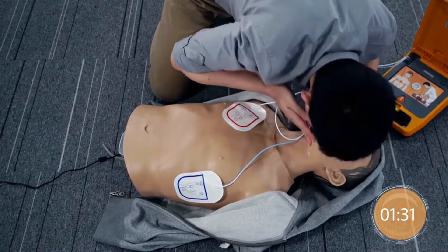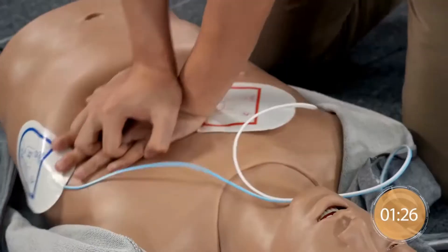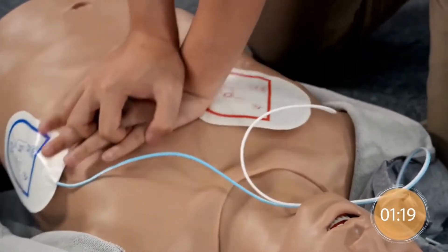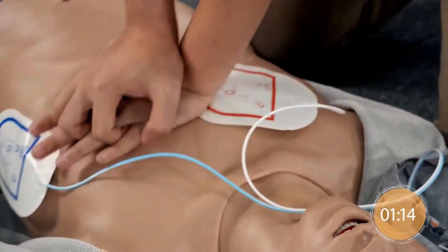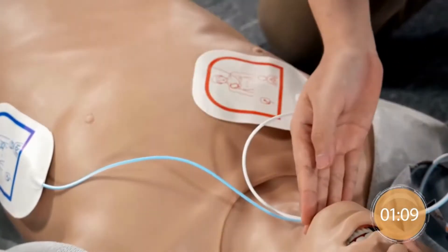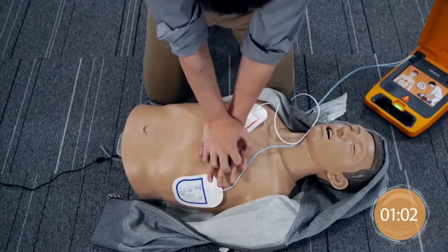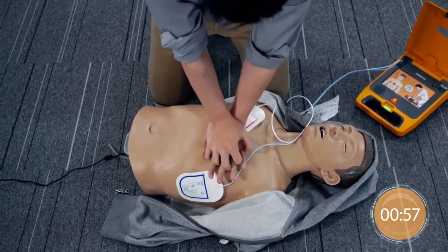Continue with compressions. Give 2 rescue breaths. Continue with compressions. Give chest compressions immediately.